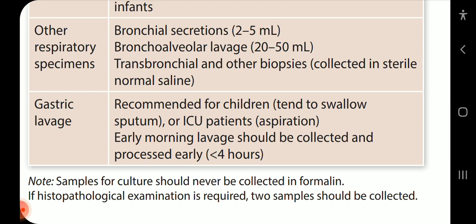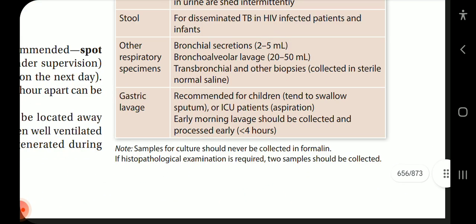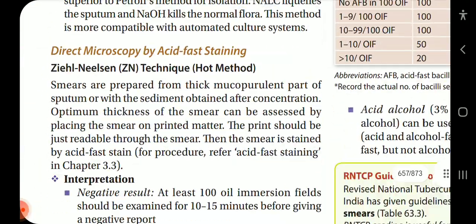Note, the samples for culture should never be collected in formalin. If histopathological examination is required, two samples should be collected.